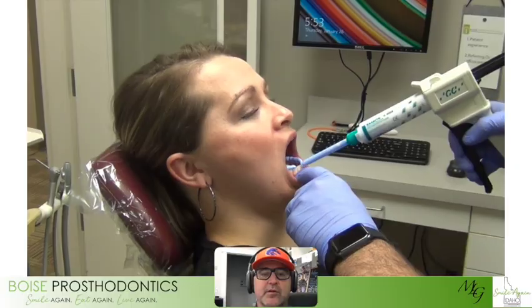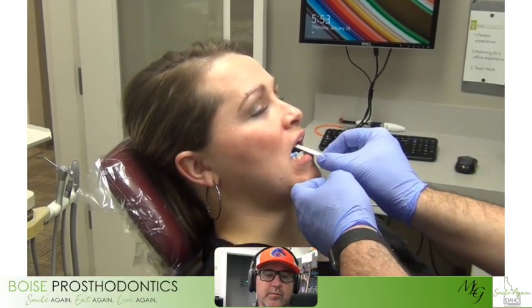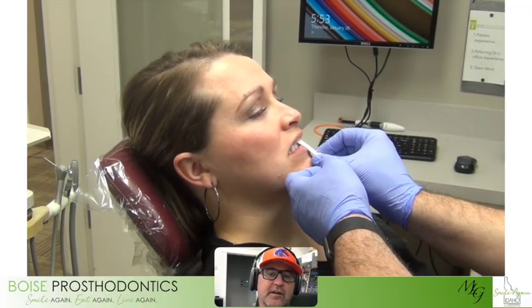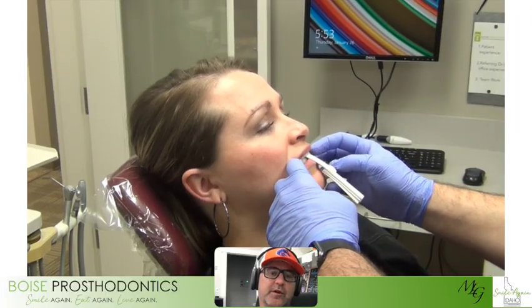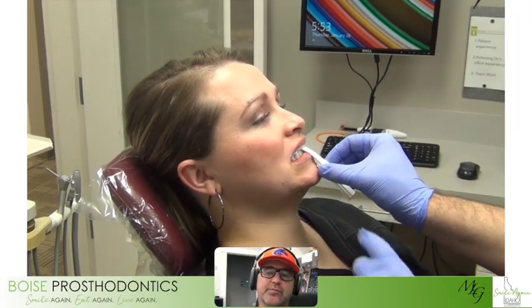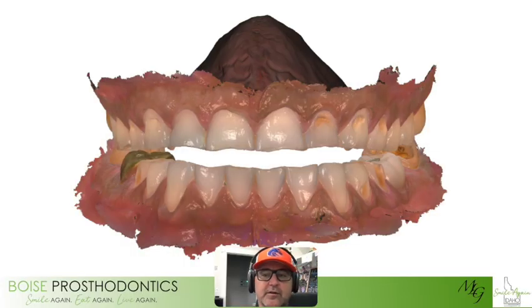Again, have them closed down, trying to occlude on their back teeth, which they won't be able to, because it's an open vertical dimension. On that leaf gauge, it seats the condyle, positions their jaw to where it should be based on the jaw joint anatomy, and the teeth are not touching at the vertical dimension that we would want. Thus, we can obtain this record.